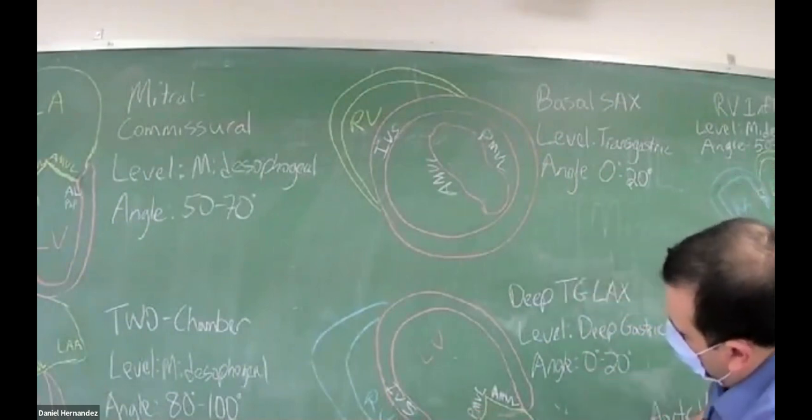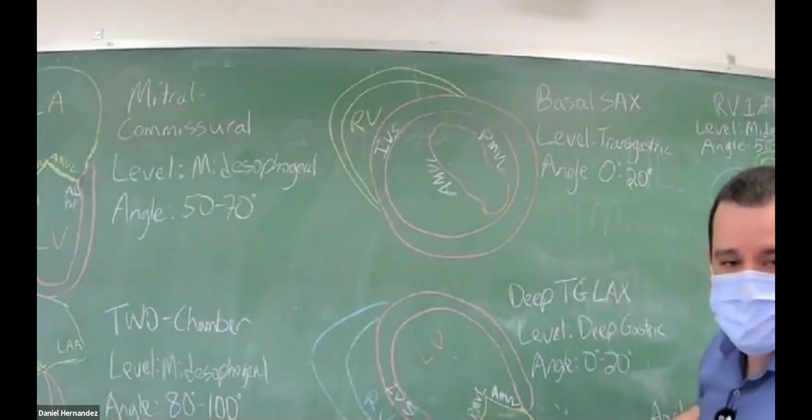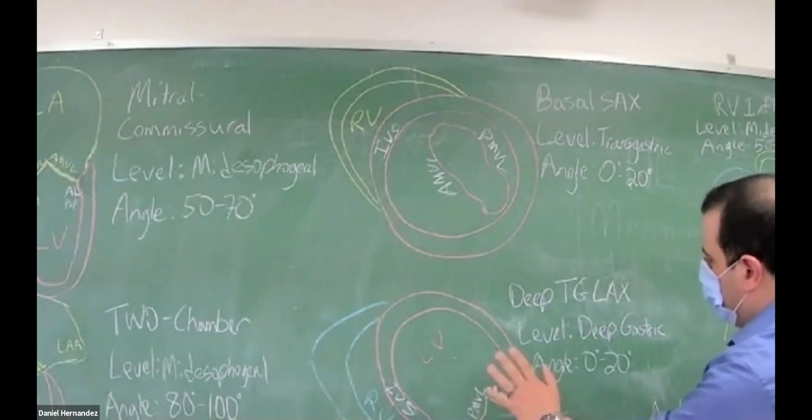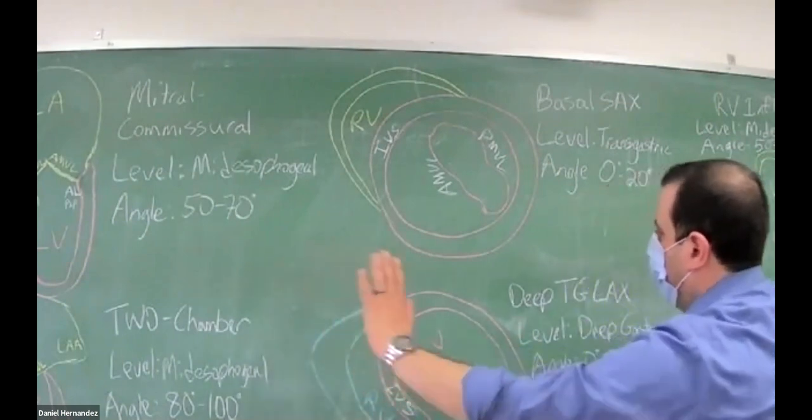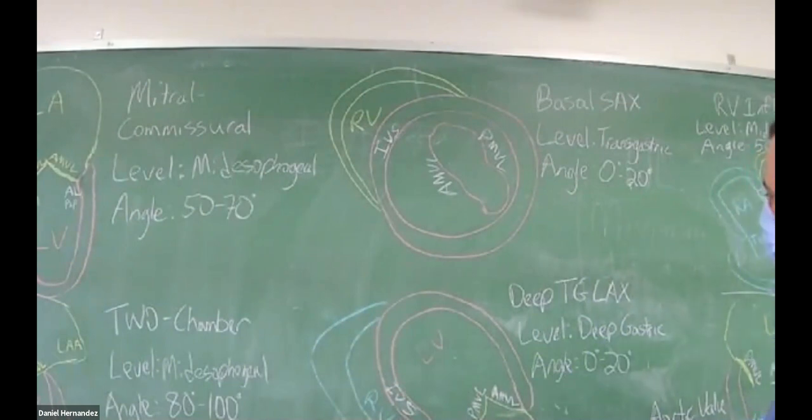A better appreciation comes if we go deeper down to your transgastric. You're going to see your left ventricle first, and your right ventricle is going to be kind of off the screen when we view it.